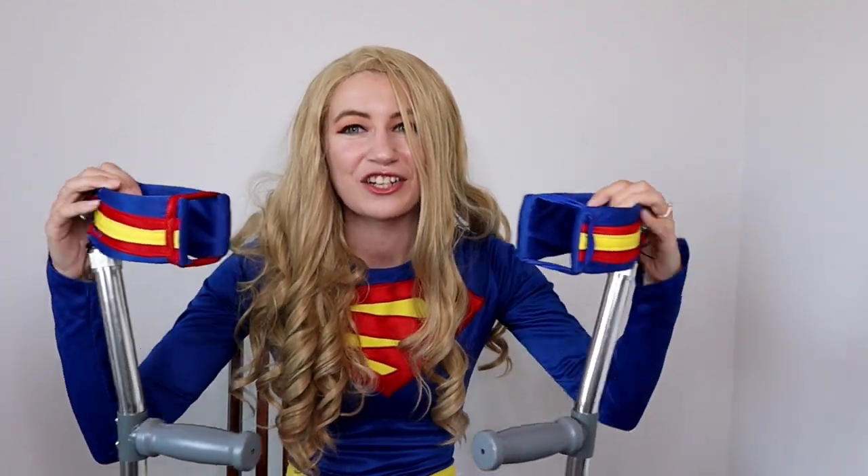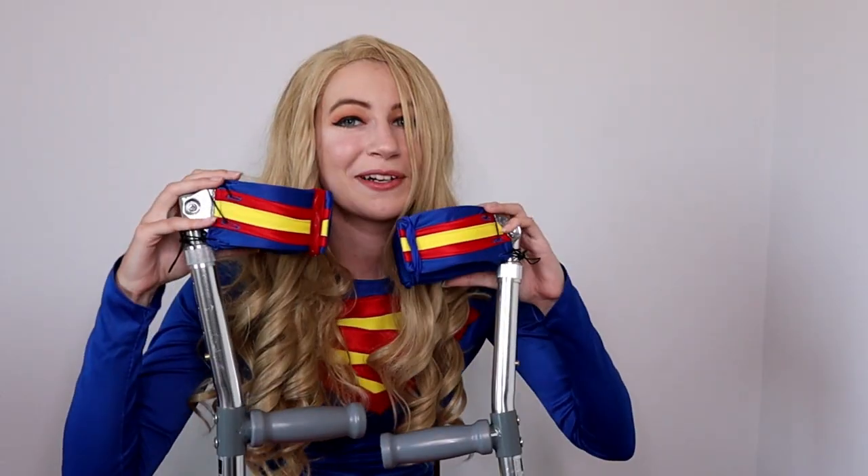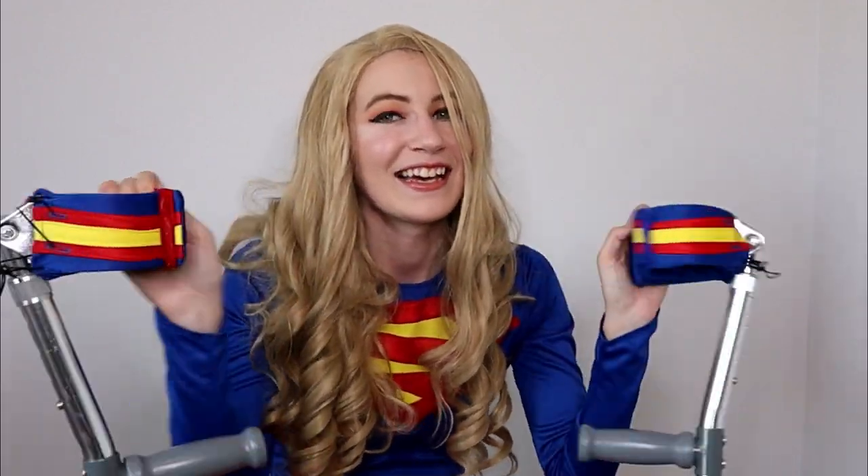Today's video is showing you how I made these covers. They're completely removable so I can make some for each costume and they'll always match, and then Reginald and Louise can always cosplay with me. So if you want to know how to make their little forearm crutch cosplays, then keep watching.